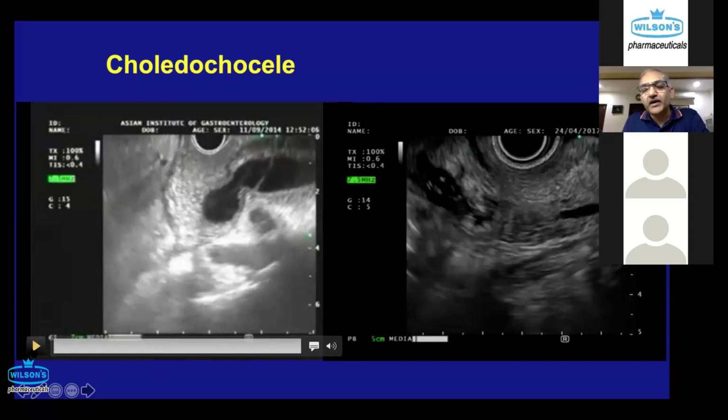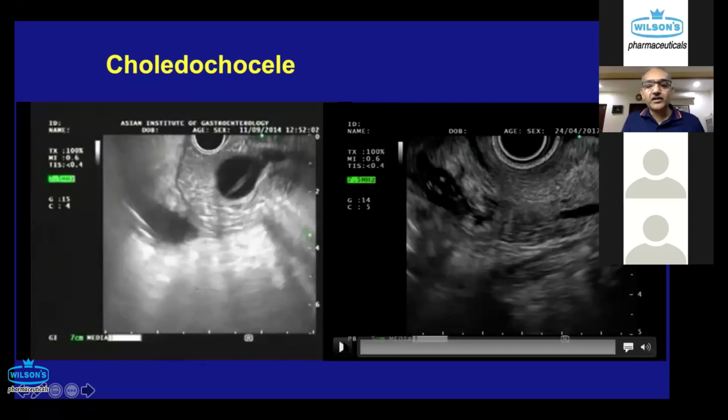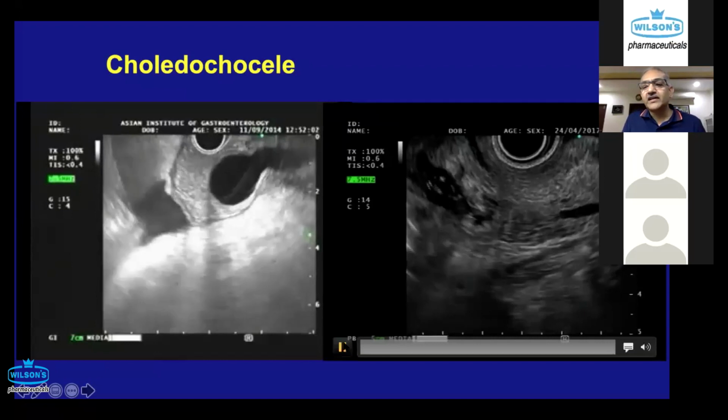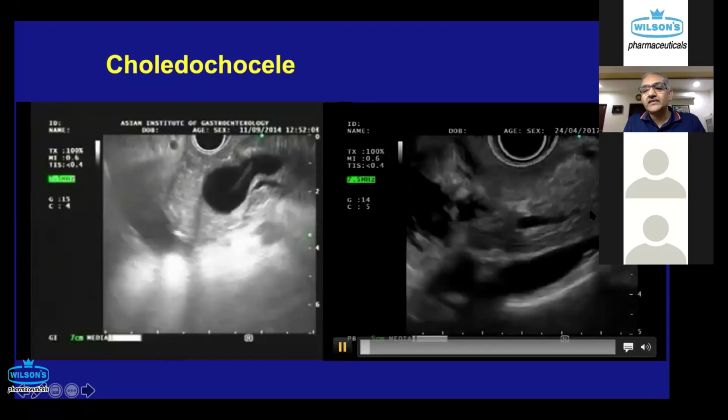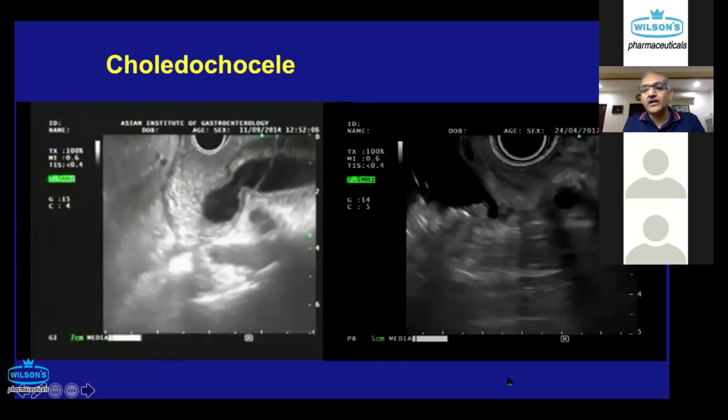Let me show you on the right of the panel. I have not given the answer; I would like the audience to be giving me the answer. So that's another patient on the right side, a different patient who has a dilated CBD. I would let the video play on its own.